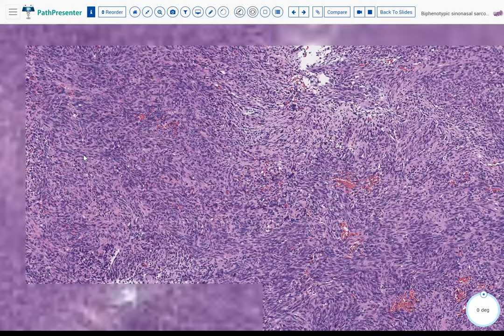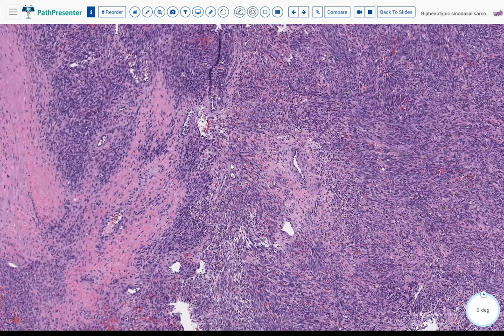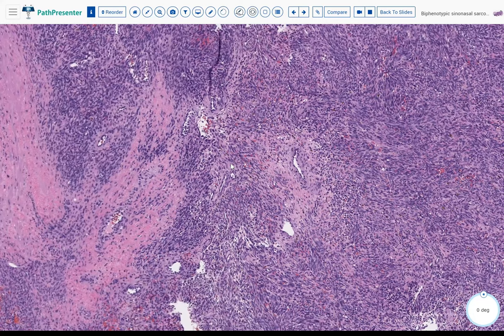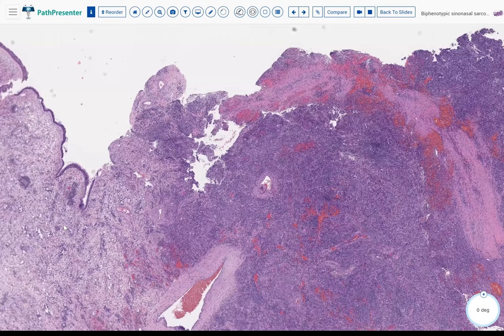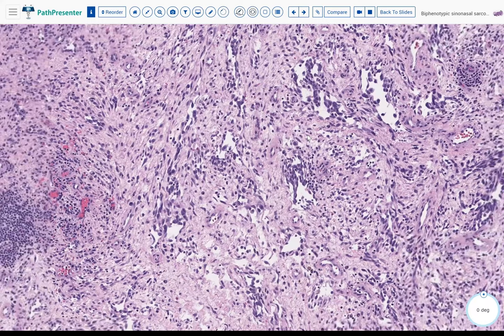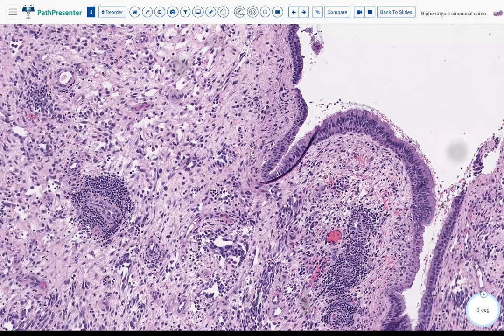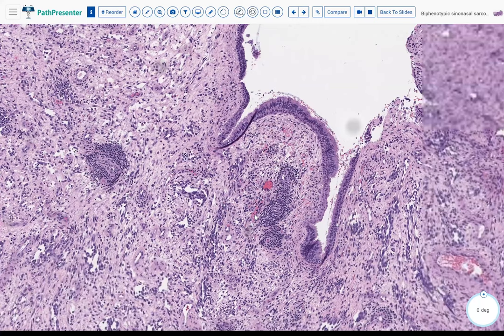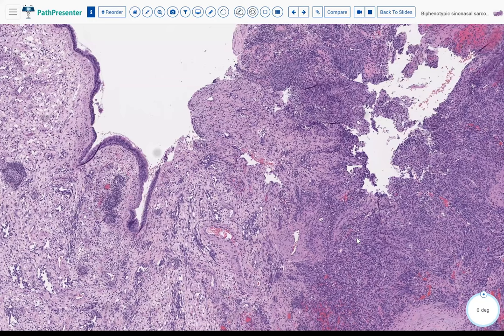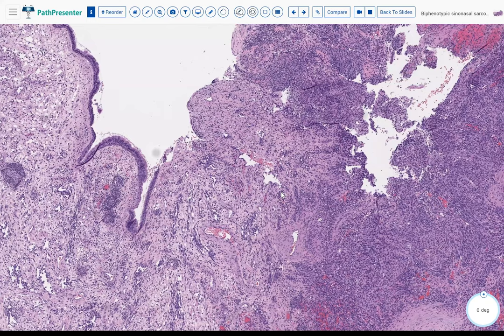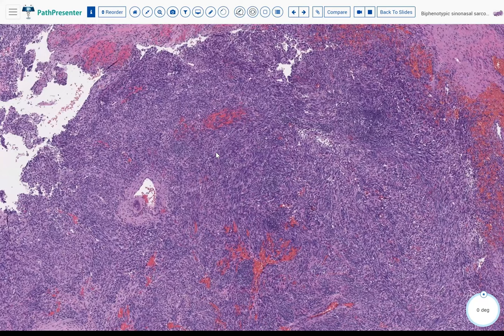There are areas with more collagen stroma, some extravasated red blood cells, and some more hypercellular areas with lymphocytic infiltrate. The respiratory mucosa doesn't show any significant cytologic atypia or in situ carcinoma. In summary, we have a pretty uniform spindle cell proliferation with hyper- and hypocellular areas, no high-grade areas, but increased mitotic activity and quite uniform morphology overall.